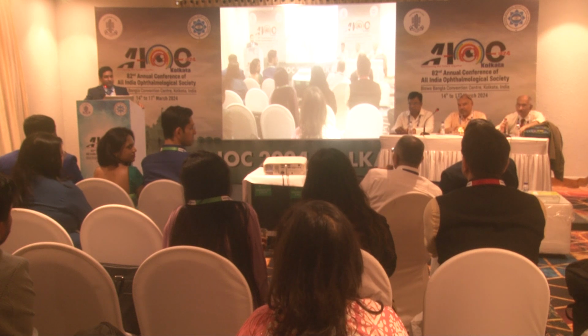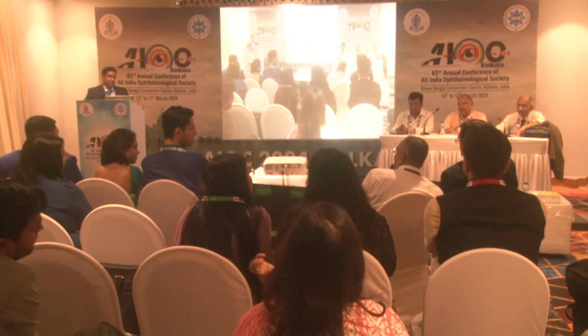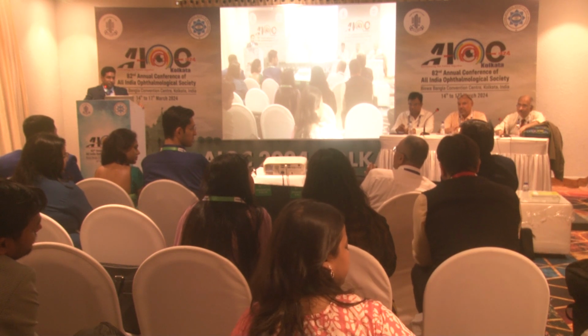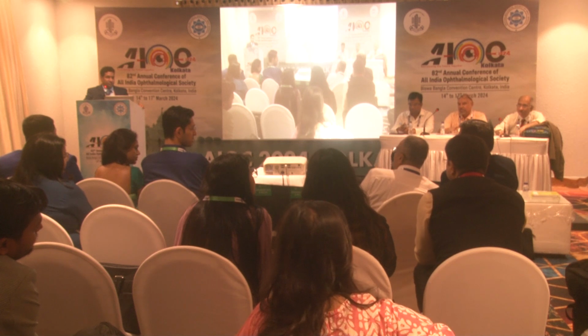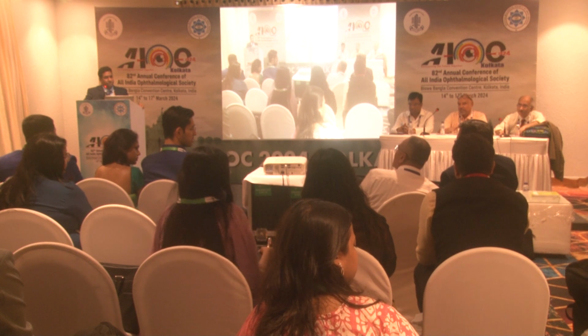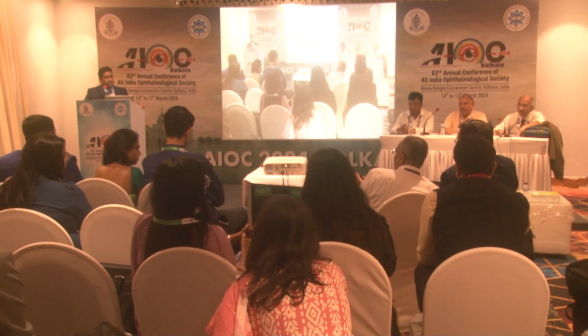Let me add to what sir has said. The particle size may be larger, but what I practice is I withdraw the drug in an insulin syringe, and I use the insulin syringe for all suprachoroidal injections. Once you withdraw, only the smaller particles will come. Then I change the syringe and inject.